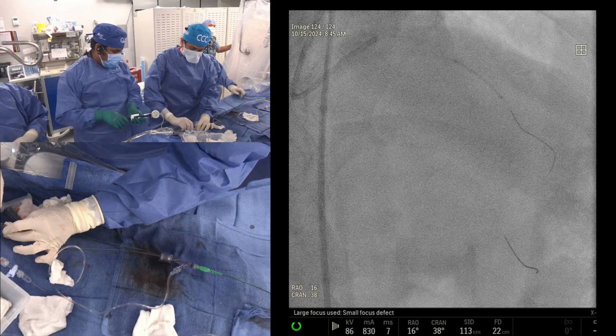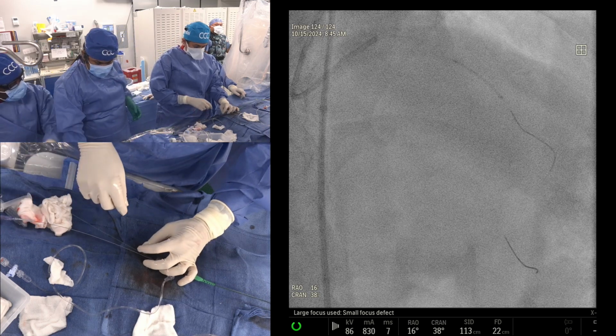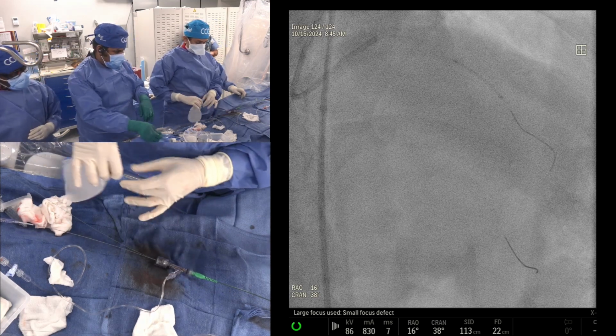People watch this so carefully. This is Nikhil Jha, who I have always recognized for making very good observations. He says on the app, the mini crush is suggesting 7 French. That is correct.